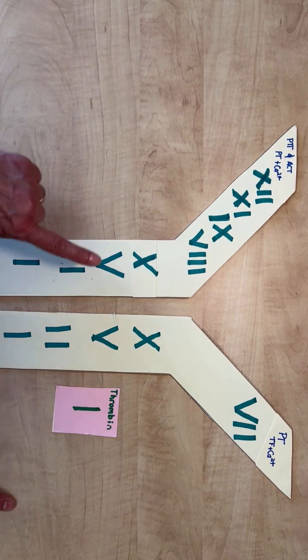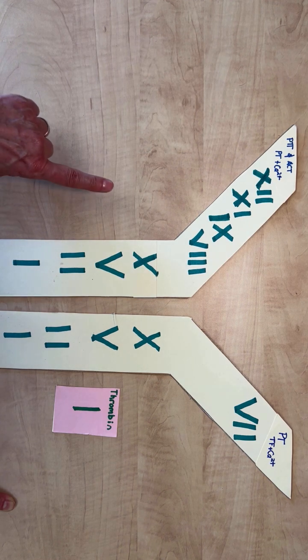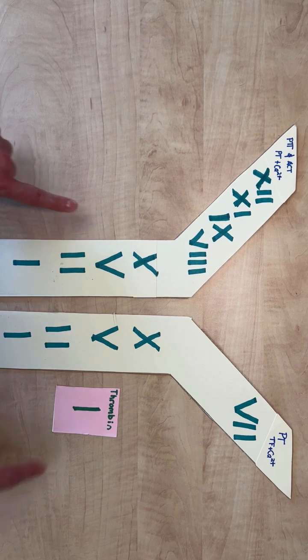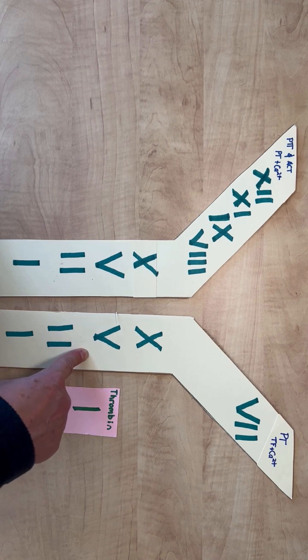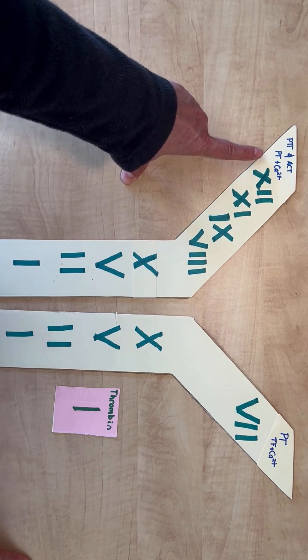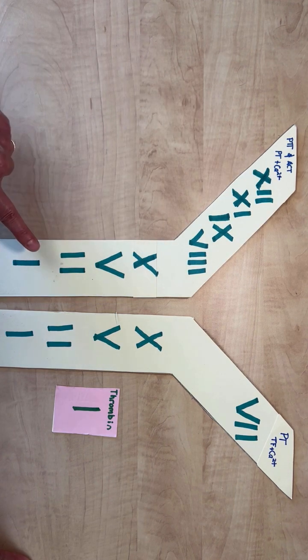The intrinsic factor pathway is assessed by the activated partial thromboplastin test, which is shortened to APTT or PTT. It gets its name because the reagent that is used in this reaction contains only the phospholipid portion of the reagent and does not contain any tissue factor, because of course if it did, it would be the extrinsic factor pathway that we were assessing. So we add the phospholipid, partial thromboplastin, and excess of calcium, and we make the forward reaction go until a stable clot is formed.